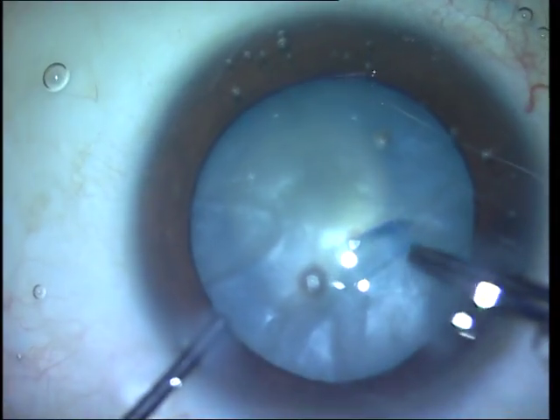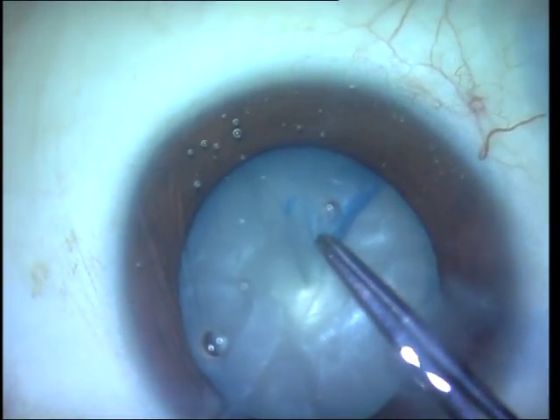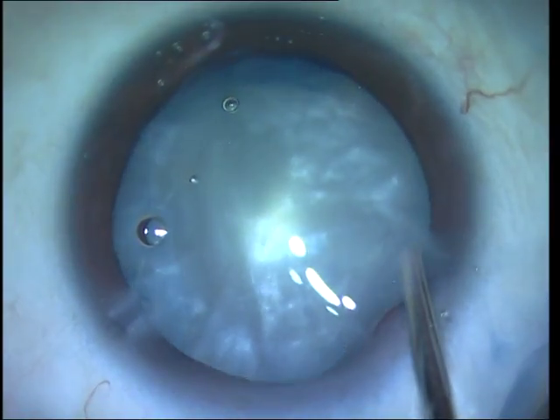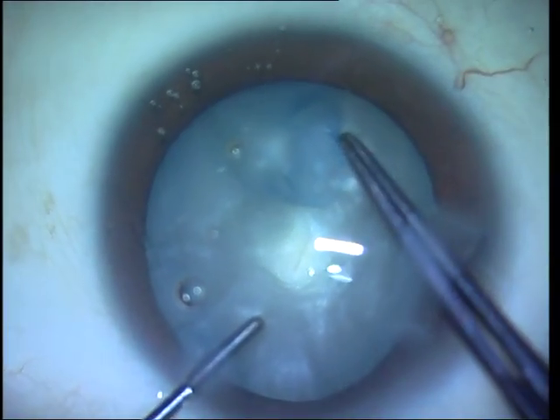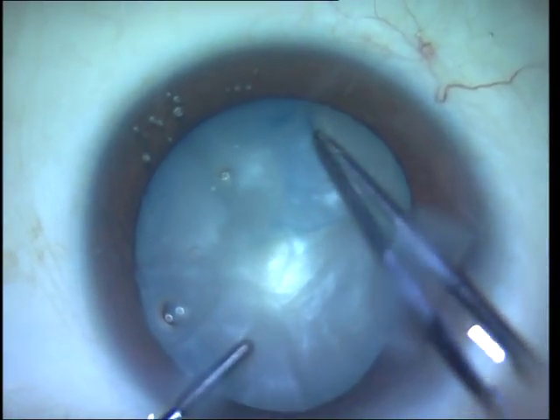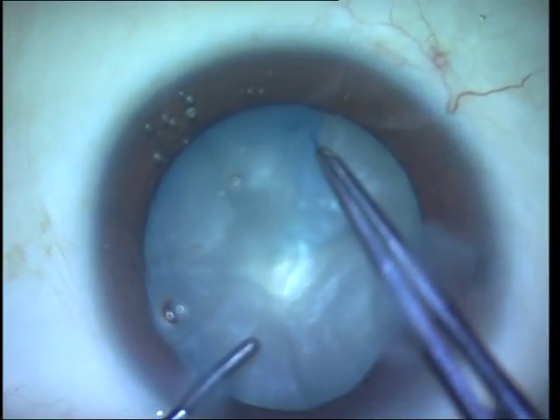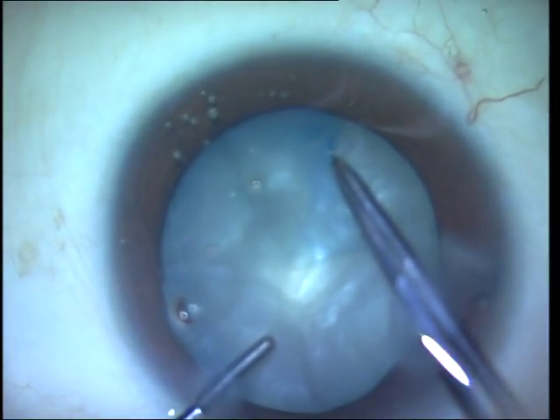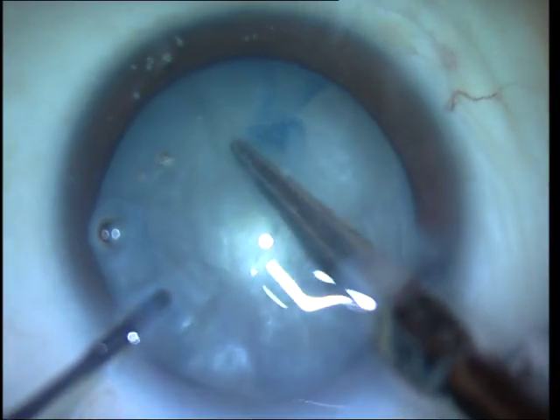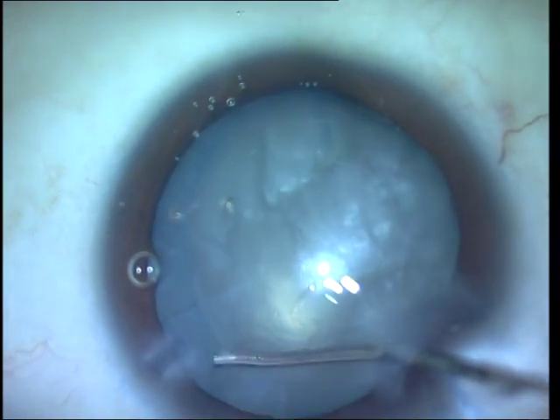What I do instead is fill the anterior chamber with viscoelastic and then use Utrata forceps to complete the rhexis. You can also see that at all points my direction of pull of the rhexis forceps is inwards. I have almost completed the rhexis and reached the edge; however, at that terminal portion I am facing difficulty connecting it to the starting point. Since I am worried this will end up becoming a wrap-around tear, I finally cut that final tag of attachment of the capsule with Vannas scissors.